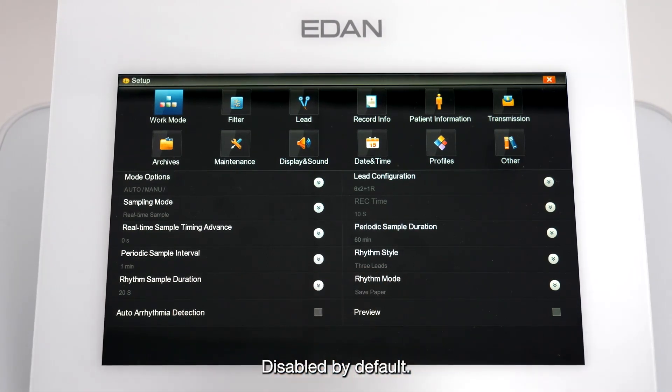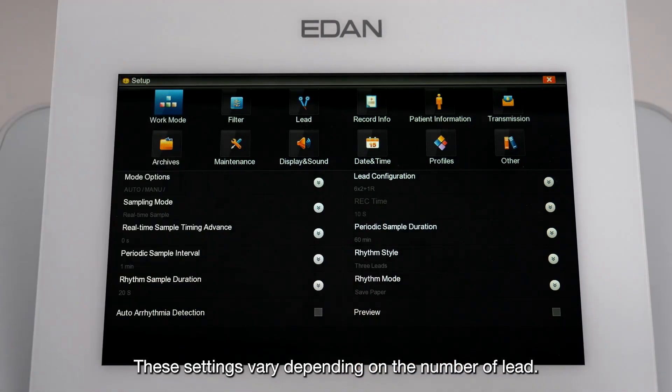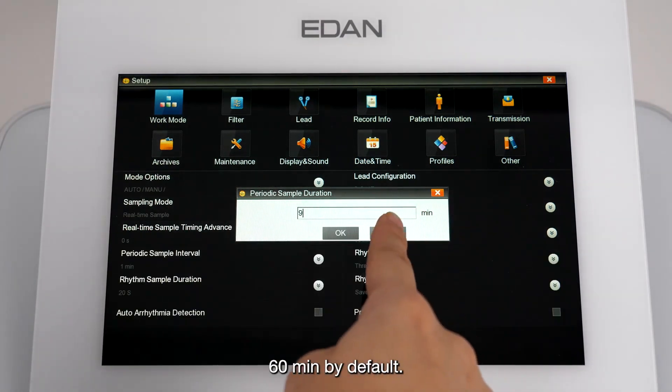Auto-arrhythmia detection is disabled by default. You can change the lead settings in the lead configuration submenu; these settings vary depending on the number of leads. Click the Periodic Sample Duration button to change the settings — it can be set to a value between 0 and 60 minutes, with 60 minutes as the default.